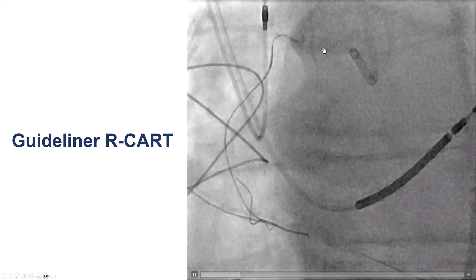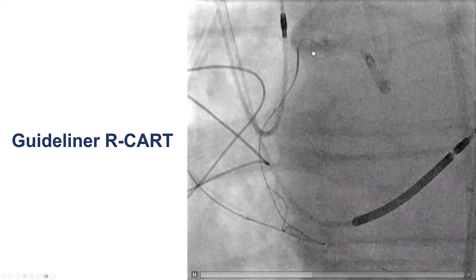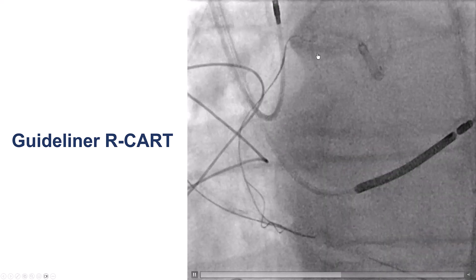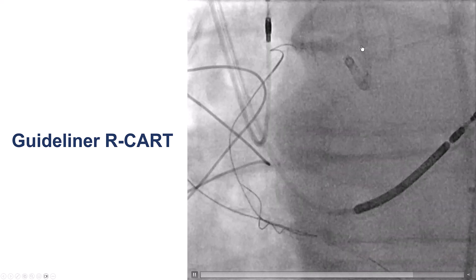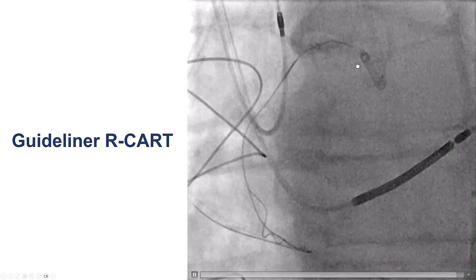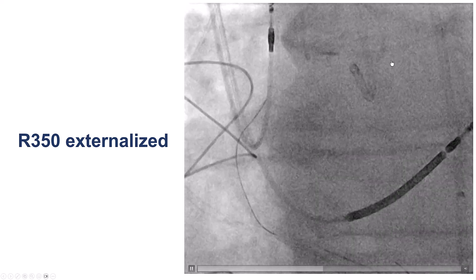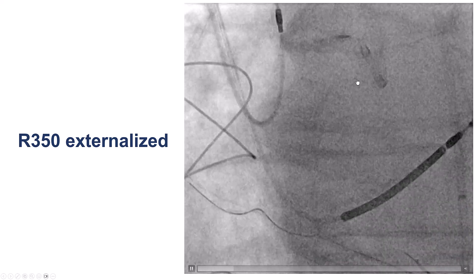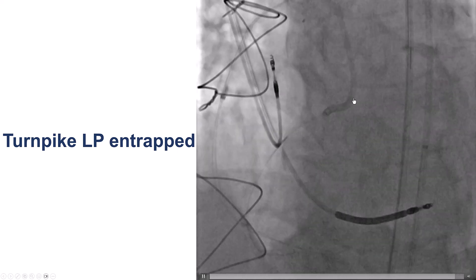We advanced an antegrade guide extension and performed a guide extension reverse CART, successfully advancing the retrograde guide wire into the antegrade guide catheter. We placed an R350 guide wire and externalized it, but then we could not get a Turnpike LP to go back. This was paradoxical because we had an externalized wire with great support, but it would not move back.